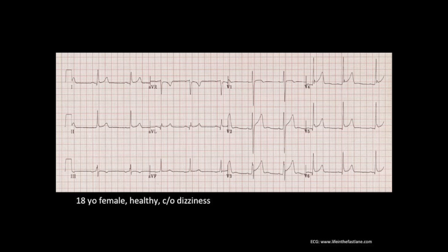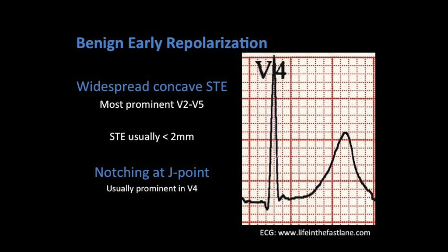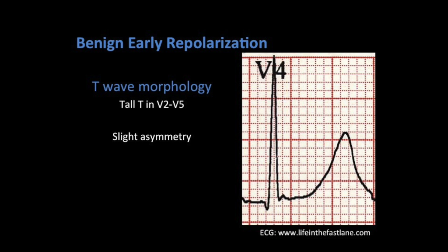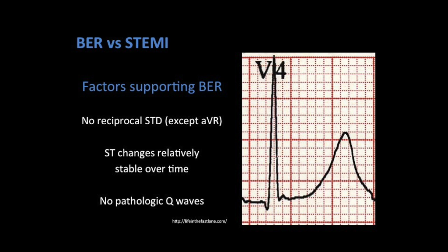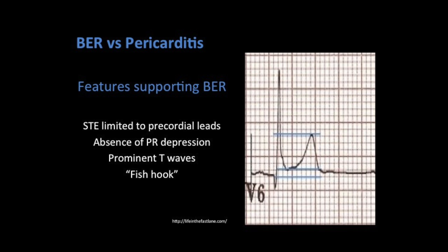This next ECG is an 18-year-old female, otherwise healthy, complaining of dizziness. This morphology is very classic for benign early repolarization, also known as J-point elevation. Classic findings on ECG are widespread concave ST elevation most prominent in the anterior leads, and notching at the J-point usually most prominent at V4. T waves are usually tall in V2 through V5 and slightly asymmetric. Factors that support benign early repolarization include no reciprocal ST depressions except maybe AVR, ST changes relatively stable over time, and no pathologic Q waves. Features that help differentiate from pericarditis include ST elevation limited to precordial leads, absence of PR depression, prominent T waves, and the fishhook or J-point notching especially at lead V4.